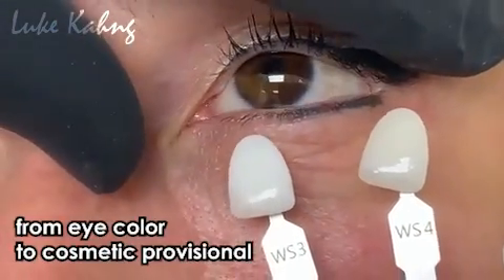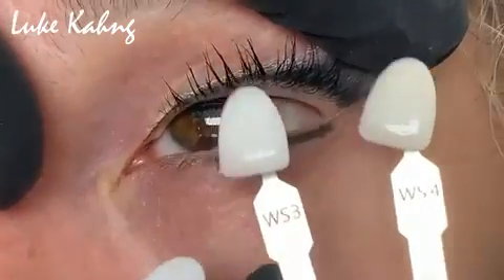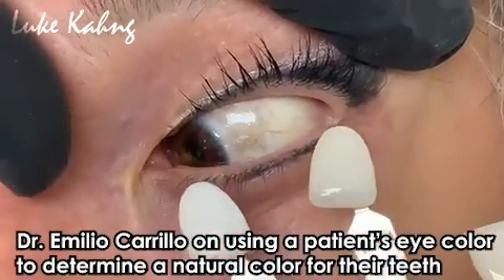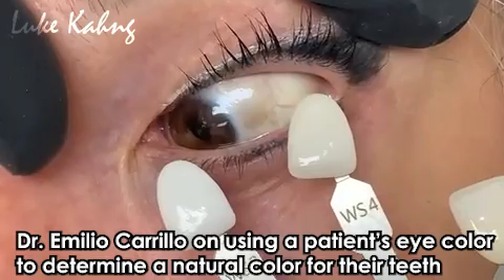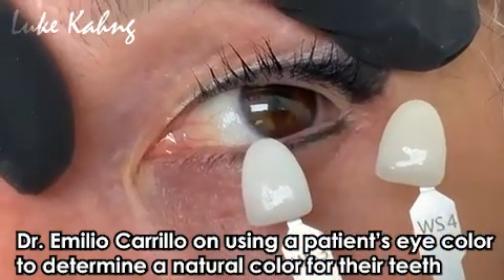When you talk — see, which one is closer? It's definitely not that one, that's too light, right? So, somewhere in between those two — you see that? Look to the other side, there you go. Somewhere in between those two is the shade that you want.